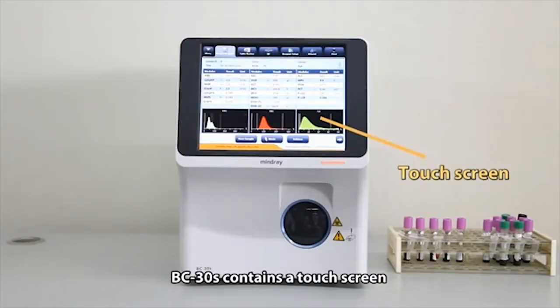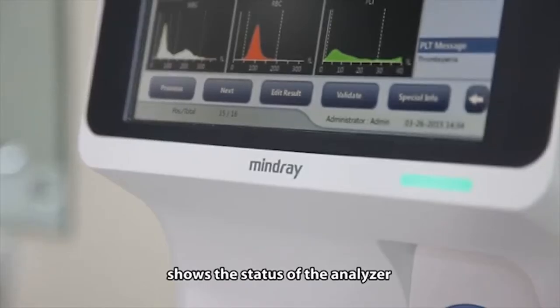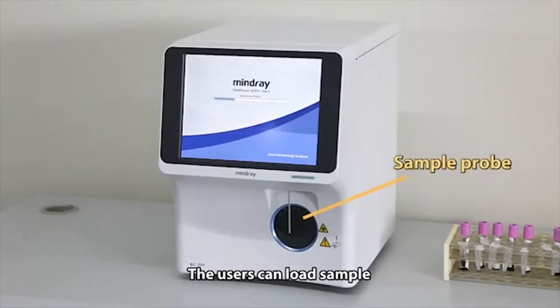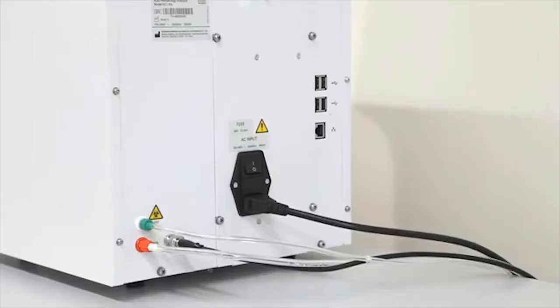BC30S contains a touchscreen with user-friendly software. The power status indicator shows the status of the analyzer. The users can load sample through the sample probe after pressing the aspirate key. You can switch on BC30S from the rear.